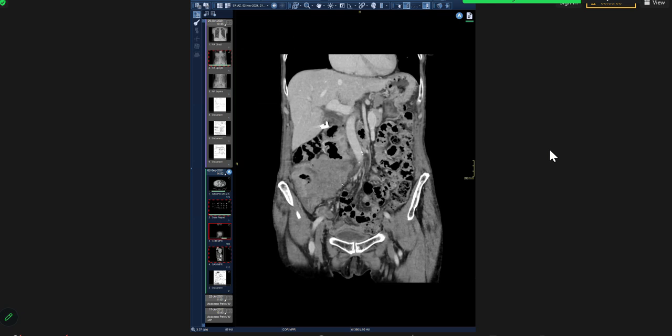So next, I would like to convey my findings to the referring physician and would recommend a CT guided or endoscopic biopsy, colonoscopy with biopsy of this mass for the definitive diagnosis. Moreover, I would like to do a completion staging CT chest and would refer the patient to the oncology MDT for further management and planning.